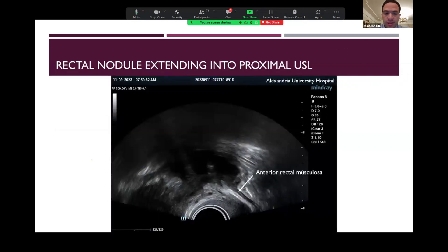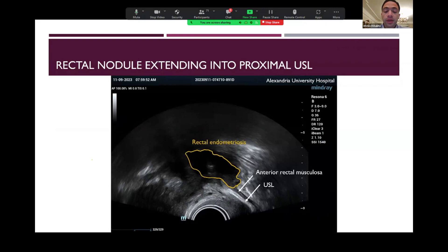Regarding the involvement of adjacent structures: as we can see here, this is the anterior rectal muscularis for this patient, this is the utero-sacral ligament, this is a large rectal endometriotic nodule, and this is extension of the rectal nodule into the proximal part of the utero-sacral ligament.